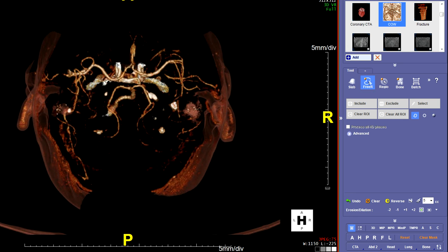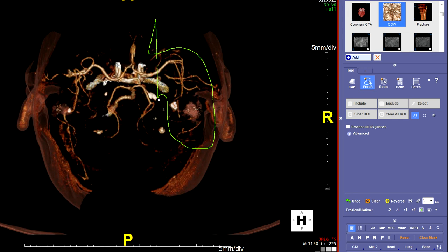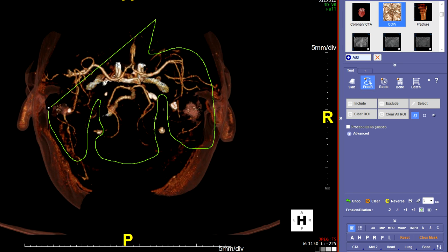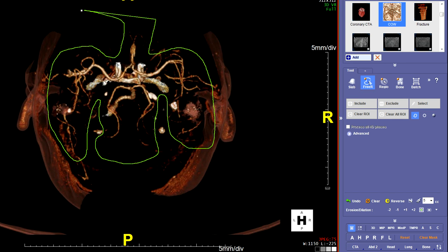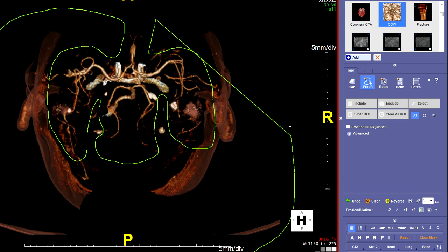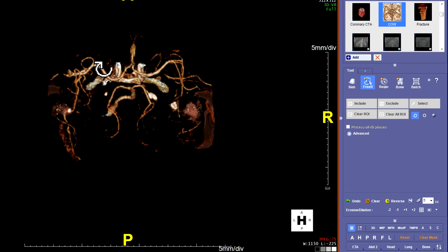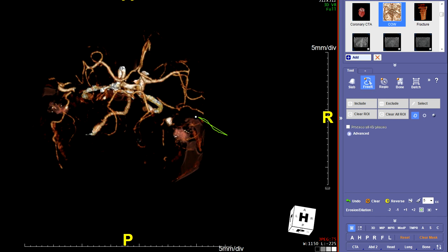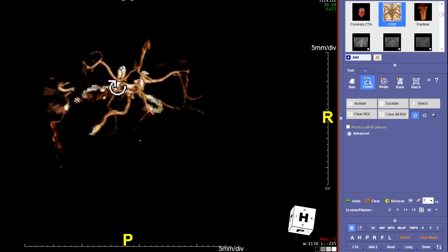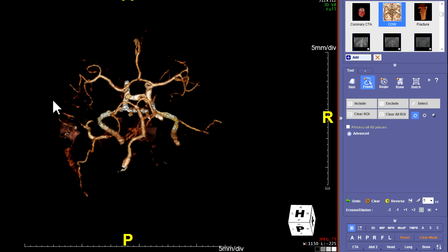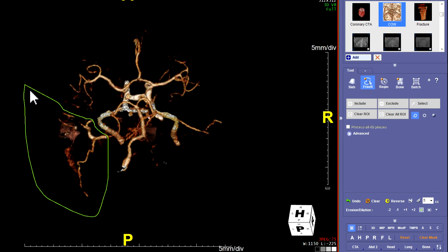Now go back to the straight head view and do the Batman cut — get all the stuff around the outside. Left Shift, come down around the anterior cerebral arteries, then around the middle cerebral arteries, get some of this out and leave the posterior cerebral arteries. Leave the middle cerebral arteries, come out peripherally, and get the anterior cerebral arteries — it kind of looks like Batman, or like a bird or an airplane. Go all the way around the outside, scoop all the other stuff out before you let go. When you let go, all that stuff disappears — that's the Batman cut. Then tilt a little one way and the other to get the sigmoid sinuses out. Tilt a little to the left and scoop, then tilt a little to the right and scoop out those vessels, circle them and get rid of them.